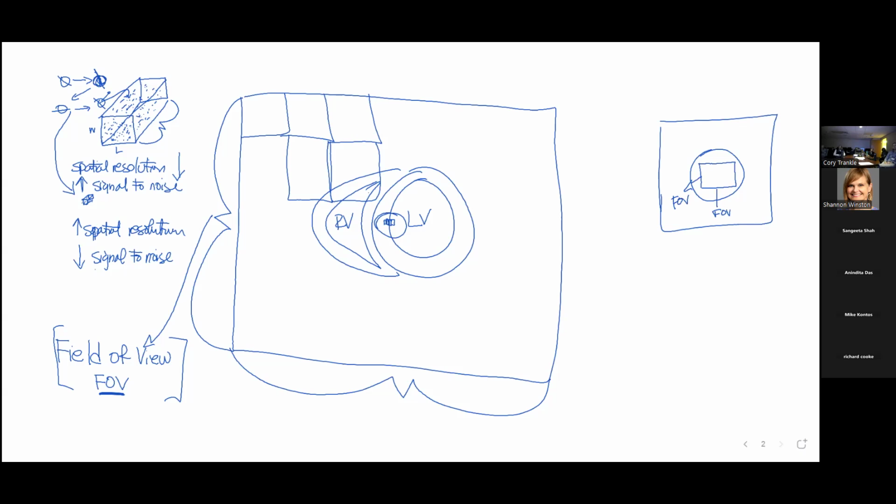Okay? You want the field of view to closely match the size or the shape that you're imaging. So a bigger person might have a larger field of view. The problem with this technology, so here's our person sitting in here. Now remember, they're lying in there, feet coming out towards you. If we set this field of view too big, way up here, we're throwing away all this airspace that we don't really need to be imaging.